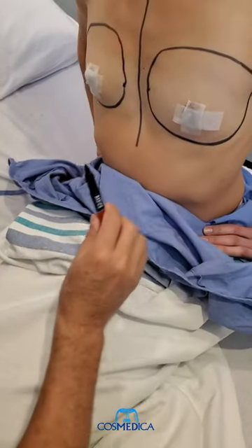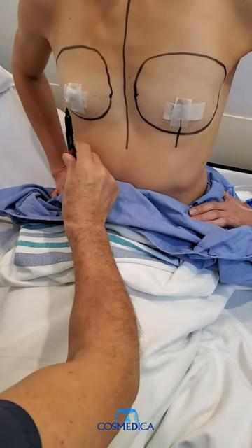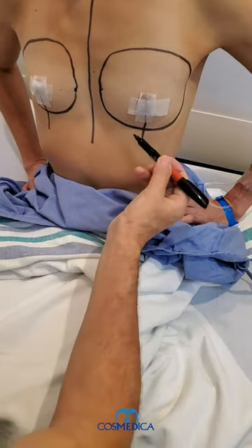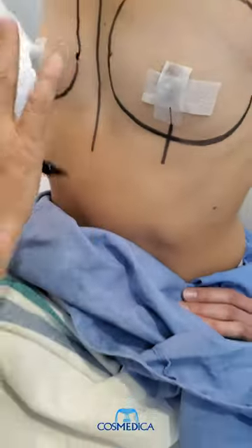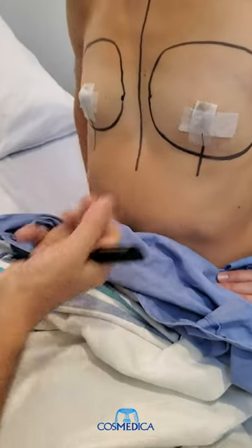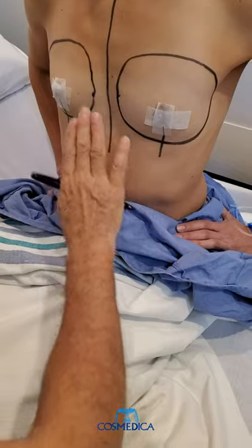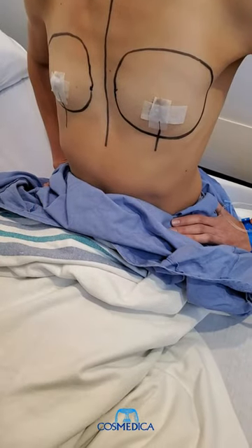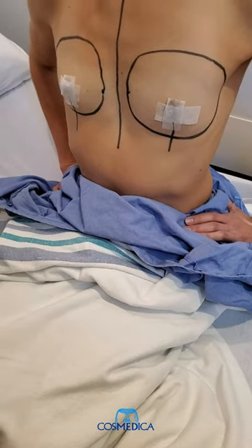So these are her current breast dimensions, and this is the midline of the nipple. We're going to make a very small incision just about here during surgery, make a pocket under the muscle, and then put the implant in under the muscle to get the maximum projection and a good fill of the full width of the breast. She'll end up with a very nice perky result.